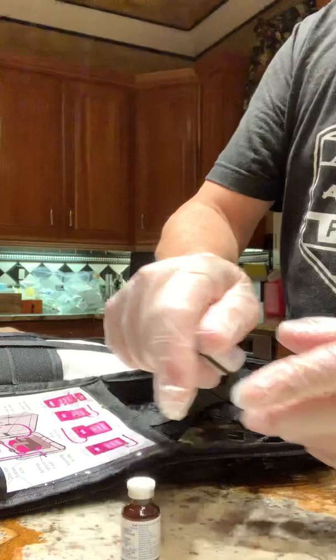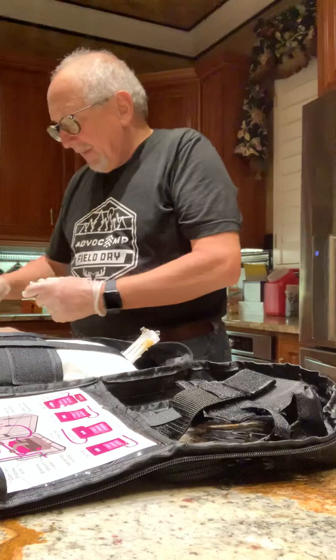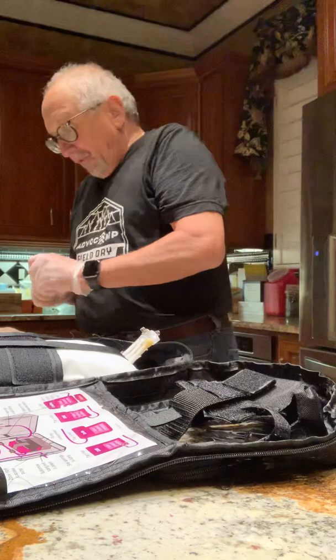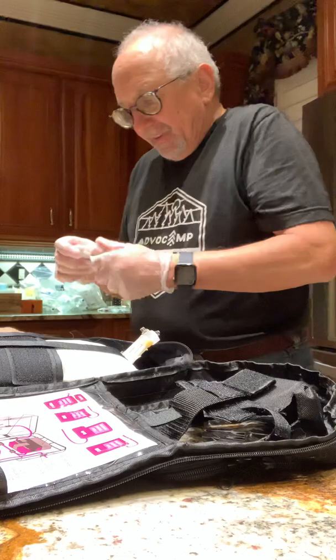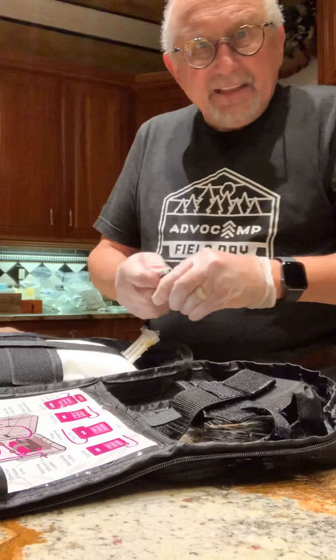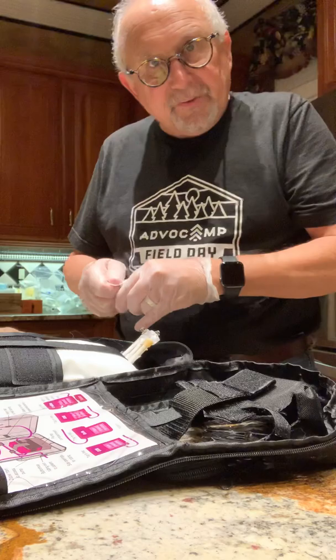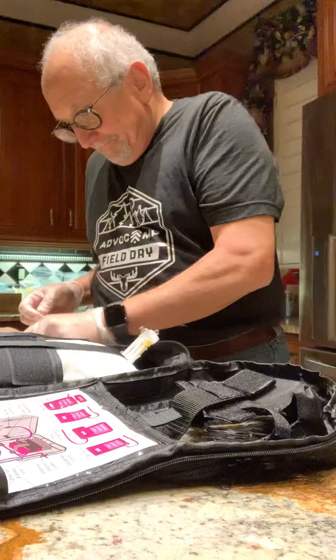This is Pepcid, used to settle the stomach, and these two are multivitamins. We're going to open these, take the safety caps off, and then take an alcohol pad and sanitize the tops of the vitamin bottles themselves. It's very important when dealing with TPN that you ensure zero tolerance — no possibility of introducing any infections into the equation.